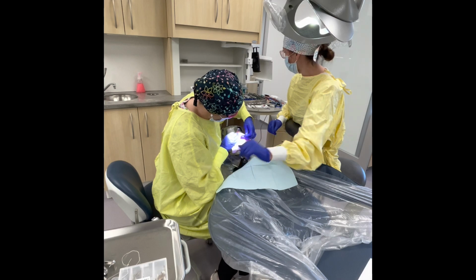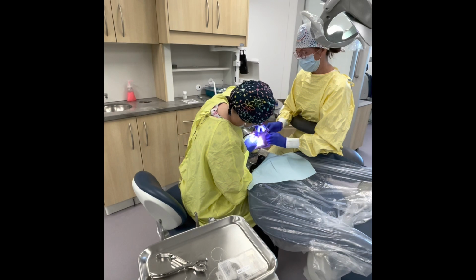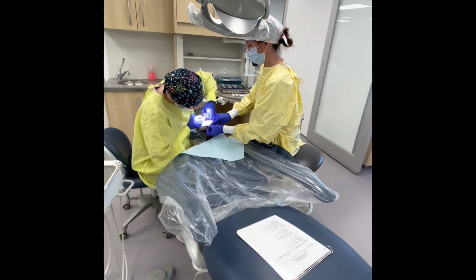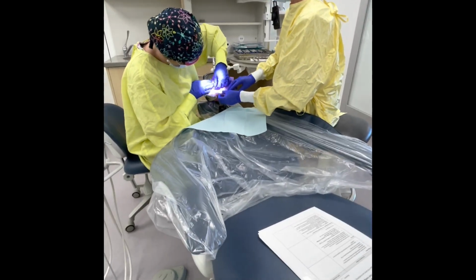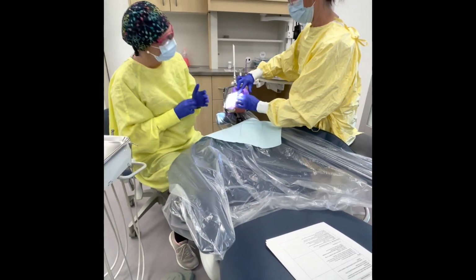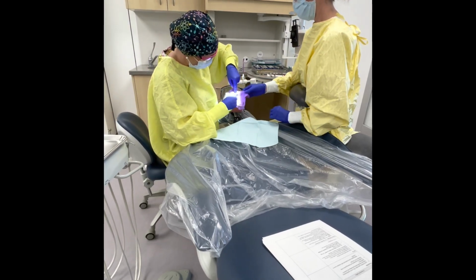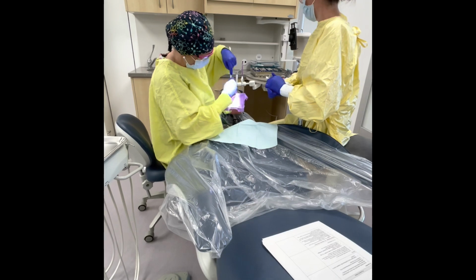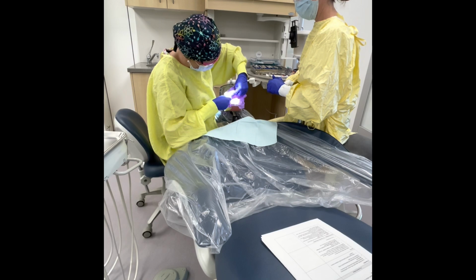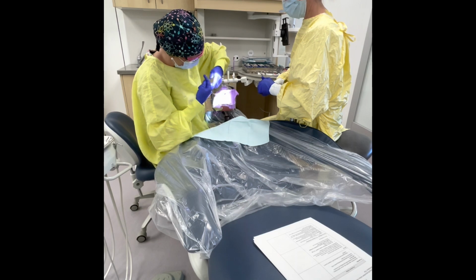And Amanda, your floss is just over on your tray. Want me to hold it? So your operator will just floss the dam down. This is not dental dam class, this is restorative class, so if the dam is not perfect, we are just trying to get it on to get you through to the next portion of this class.